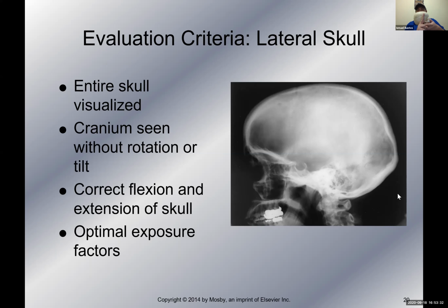And you saw two structures in there supposed to be superimposed. If I rotate the skull, right, let's go this way, rotate the skull, you'll see structures move within the skull, right? There'll be anterior, posterior separation. Then that means you have rotation, right? The first structure you should look at for rotation is the mandibular rami, which are these structures down here, right? So we're gonna look at the mandibular rami. If they're rotated, you're gonna see one on each side, right?